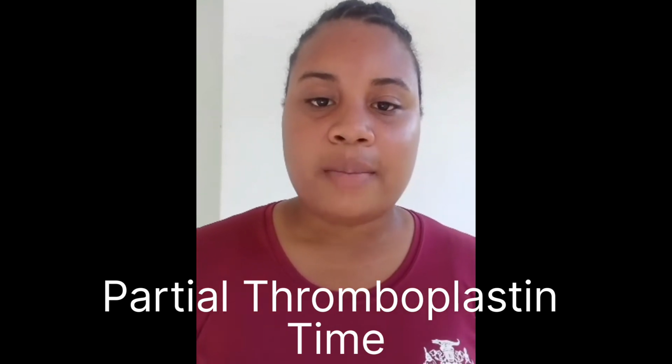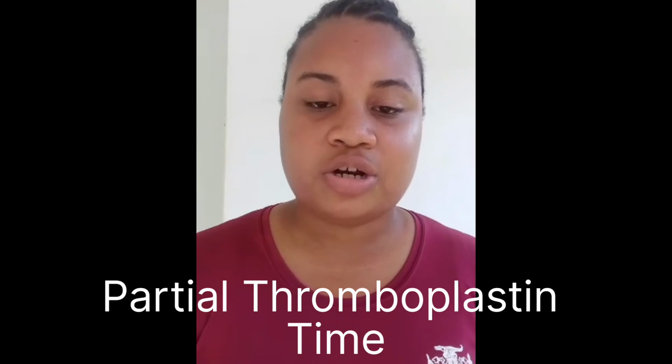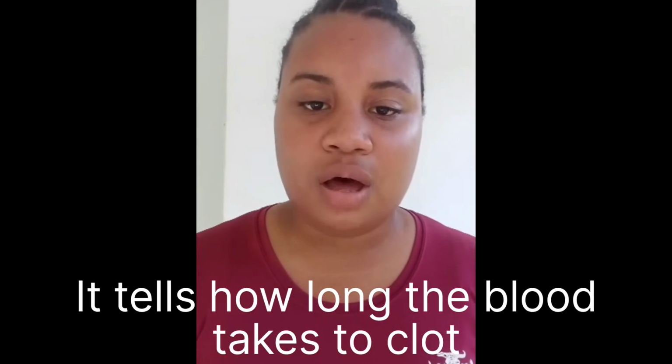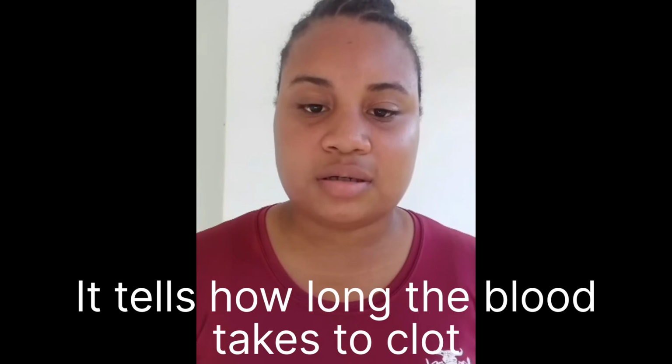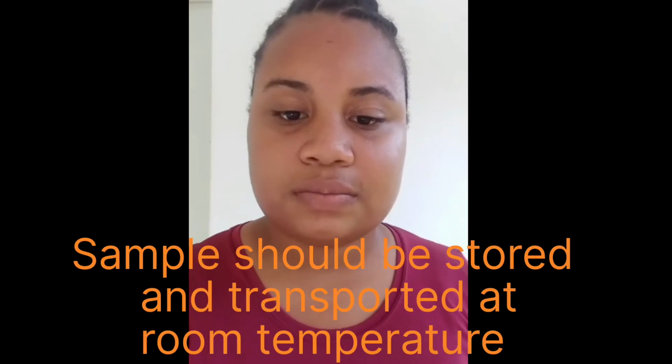Good morning, everyone. Today I will be presenting on partial thromboplastin time. Partial thromboplastin time is the blood test that tells how long the blood takes to clot. Special preparation is not needed for PTT, but healthcare providers require patients to stop taking certain medications like heparin before the test because it can affect the results.